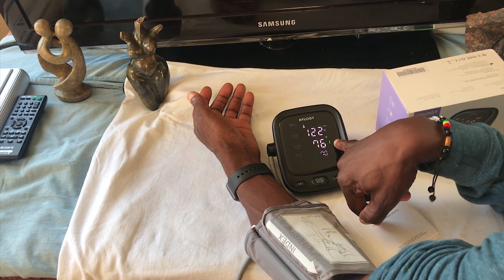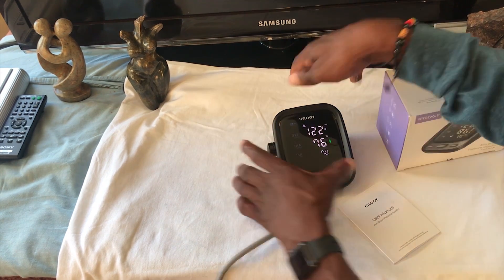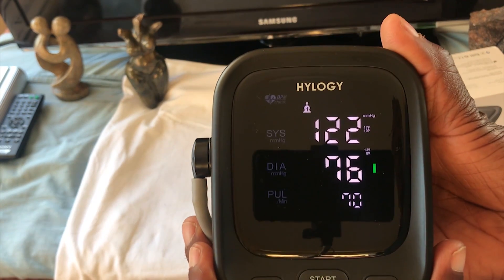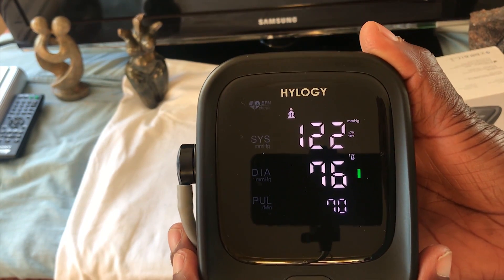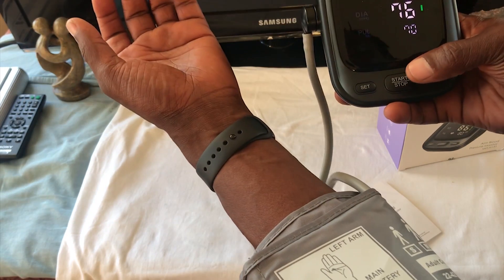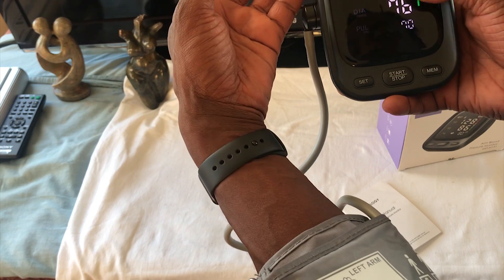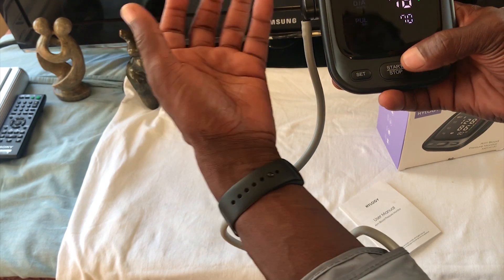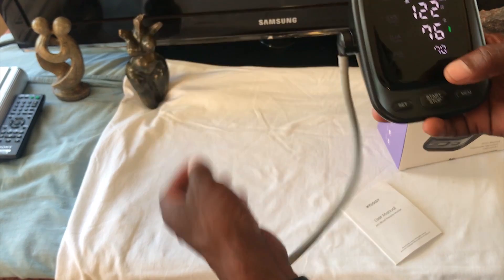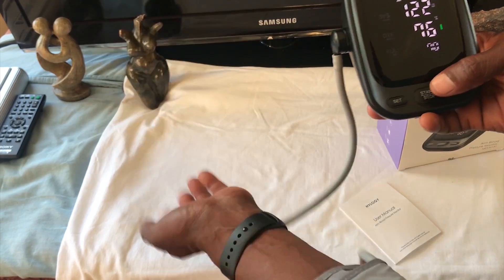It has an indicator here — as you can see it's green. I'll put it up to the screen so we can see it more clearly. If I do the test while standing up, for example as I am now, it might shoot up because my blood pressure is higher when I'm more active. So let me just activate my arm and you'll see the difference.